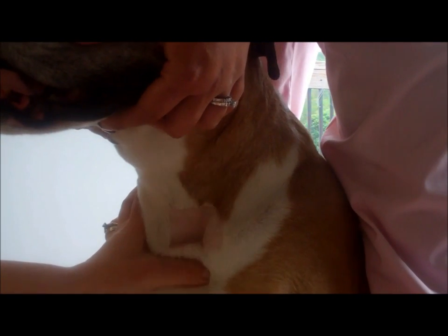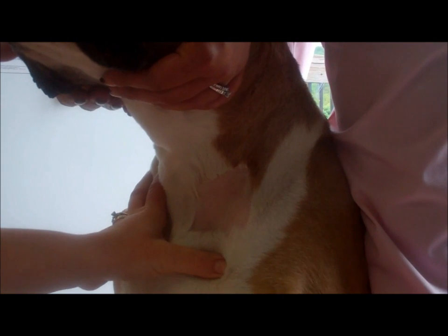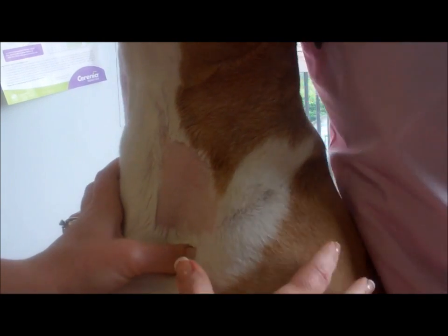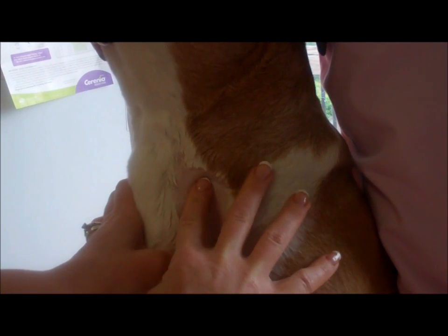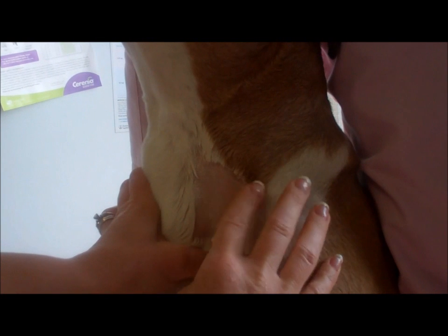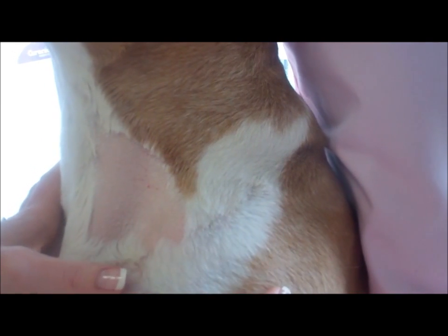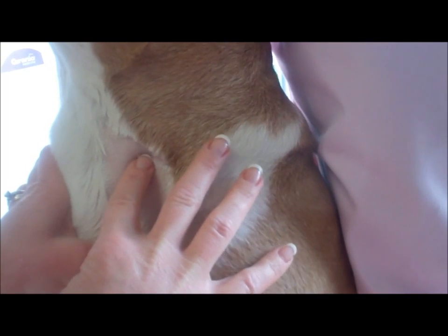You're going to wipe with alcohol, but as you can see, the way he's being restrained right now makes it very hard for the jugular vein to be seen. If I ask for his head to be lifted and push in and up, it's still difficult. But if Ashley lowers the head just slightly, when I push, it kind of pops up — and if you release, you'll see it disappear. It's right here. Push in and up and it filled back up.